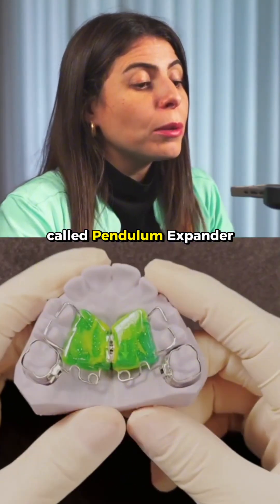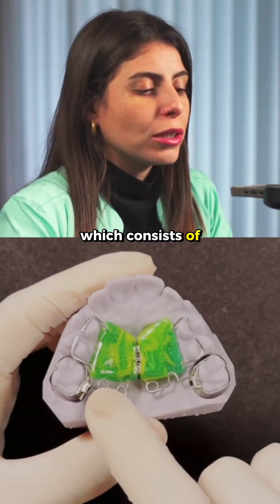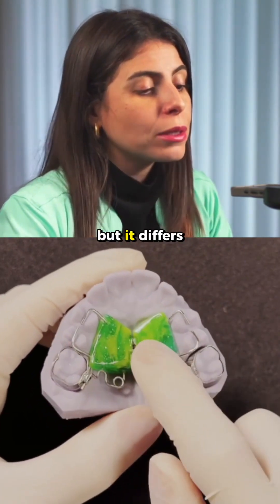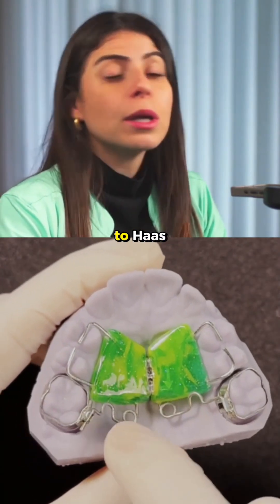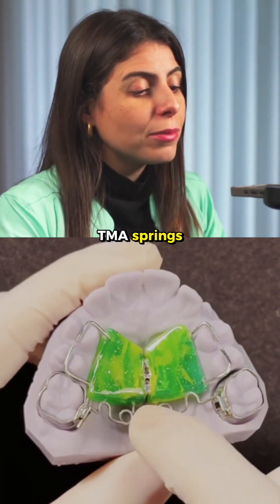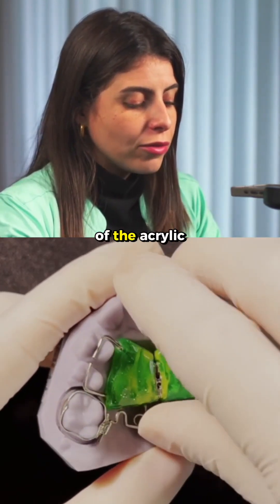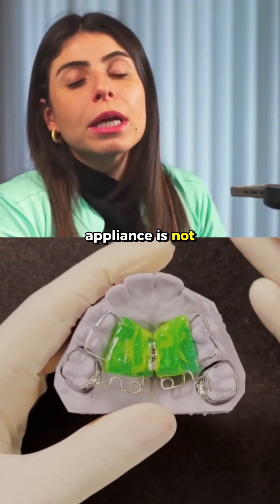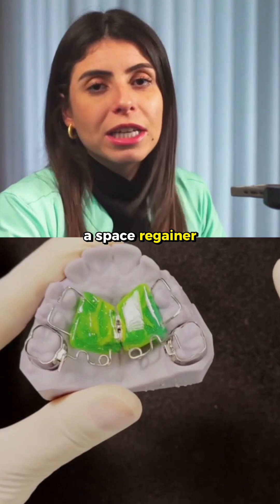This device is called the Pendulum Expander, which consists of an acrylic button similar to a Haas appliance, but it differs from the Haas appliance due to these TMA springs that are placed at the back of the acrylic. Notice that the Pendulum Expander is not only used as a space regainer.